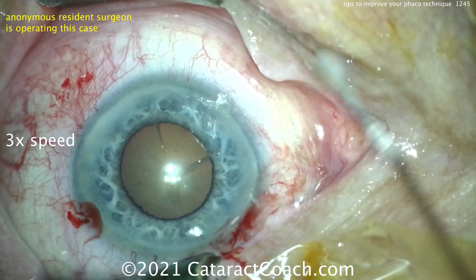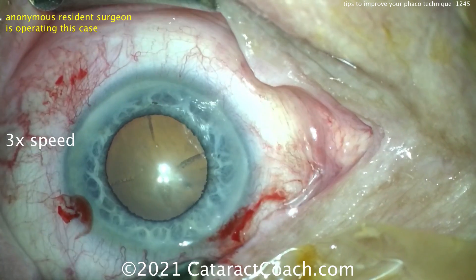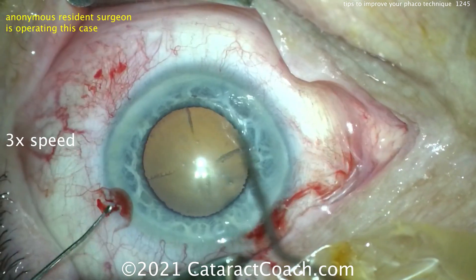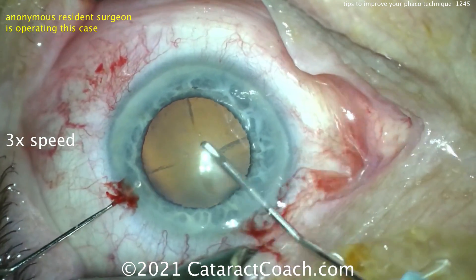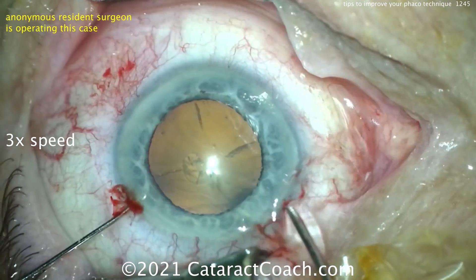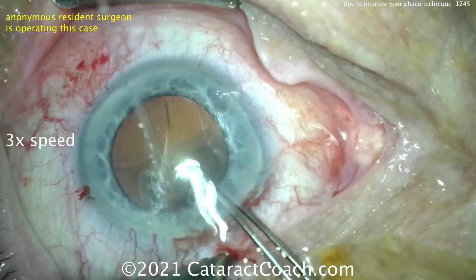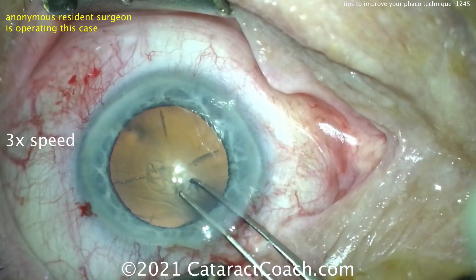Good move — I'll give you proper appreciation for that, it was a good move. Look at that pupil dilating up much more widely — that is great. Fixating the eye, starting with the cystitome and getting a rhexis done here — not too bad, got a nice little flap turned over there. Now the trypan blue dye didn't appear to do a whole lot; I don't see much blue dye on that capsule.